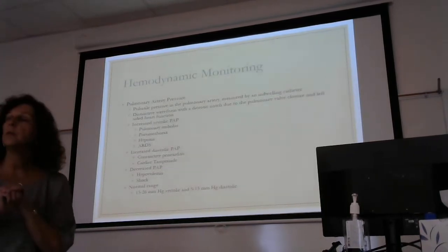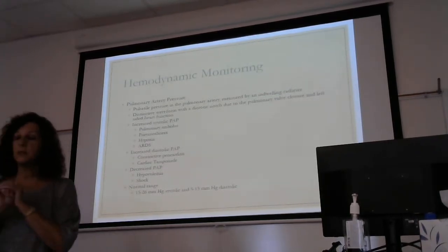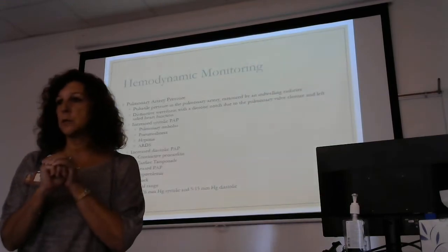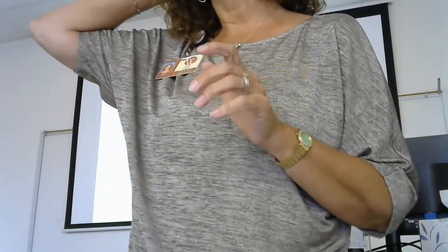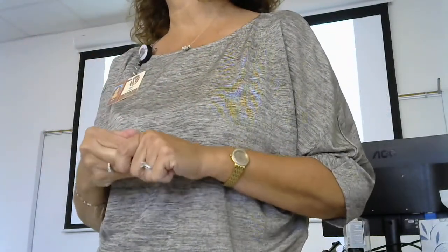Okay. Now, because of where the terminal end of this catheter sits in that pulmonary artery as it's approaching that pulmonary bed, we can use it a lot to manage our left ventricular heart failure patients.